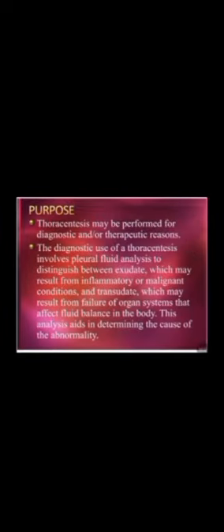Purpose of thoracentesis. Thoracentesis may be performed for diagnostic and or therapeutic reasons. The diagnostic use involves pleural fluid analysis to distinguish between exudate, which may result from inflammatory or malignant conditions, and transudate, which may result from failure of organ systems that affect fluid balance in the body. Analyzing the fluid aids in determining the cause of abnormality, for example, pleural effusion, infection, tumor.